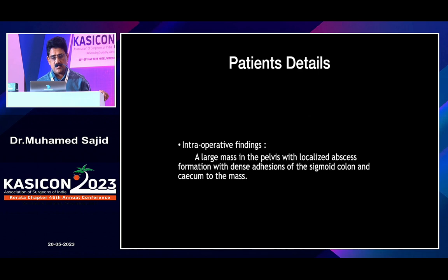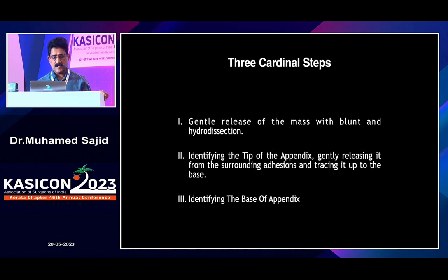As the patient was in pain, we proceeded with laparoscopy. There was a large mass in the pelvis with localised abscess formation and dense adhesions of the sigmoid colon and cecum to the mass. Whenever we encounter an appendicular abscess, these are the three steps: there will always be adhesions, so you gently separate them, then try to find the tip and the base of the appendix.